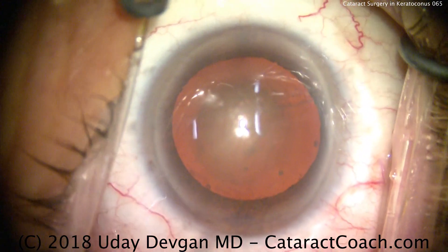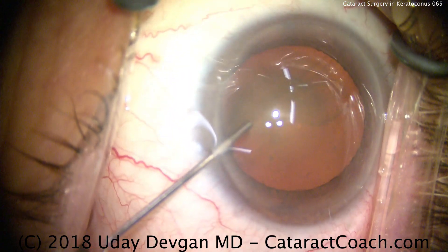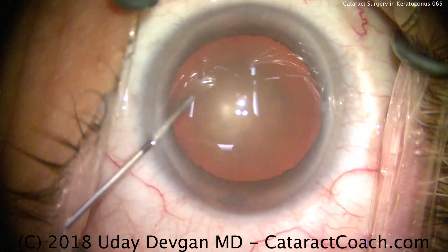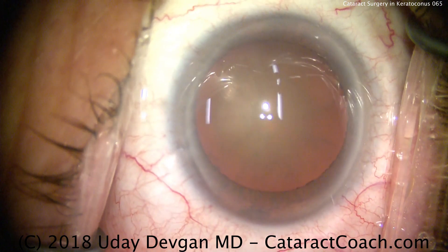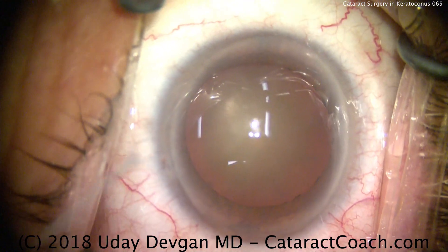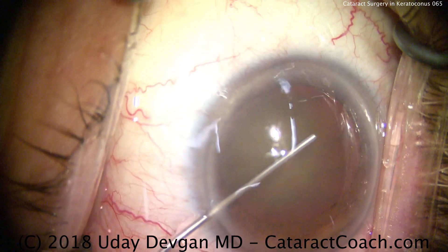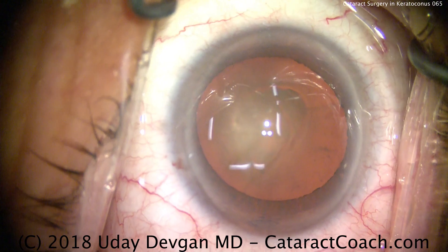First thing is, look at the central corneal light reflex. See those three lights in the center of the cornea? Now when the eye moves, look how the lights get distorted — they spread apart and then they're narrower. That's just a small indication of how irregular this cornea is. This patient has had keratoconus for most of his life, and the cornea is very irregular with a high degree of inferior steepening.